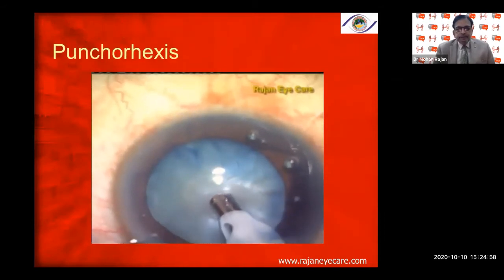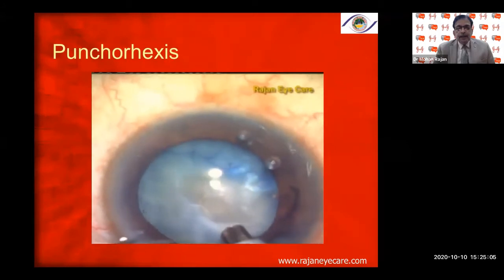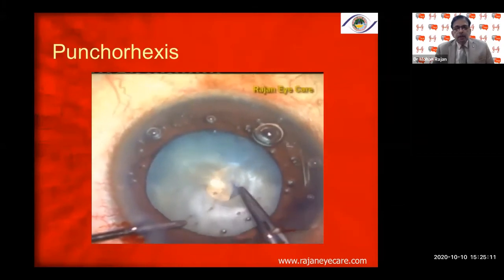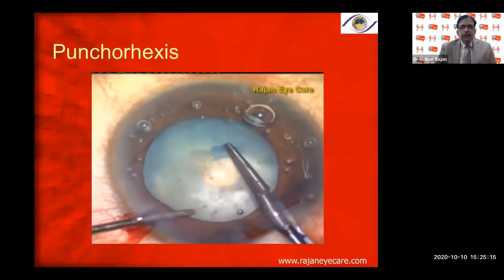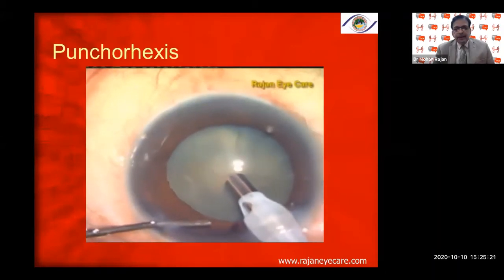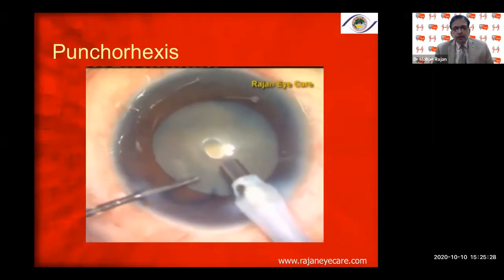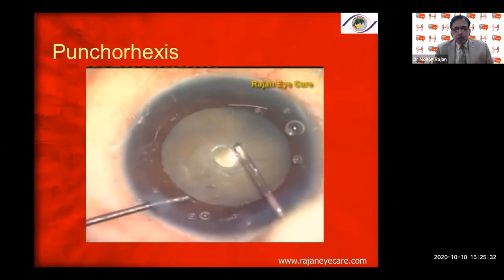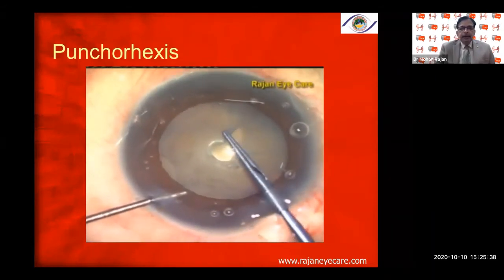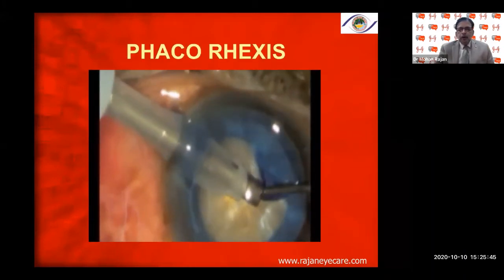You can see me punching — as I punch, I go all the way down on the foot switch. I'm not only punching the anterior capsule and decompressing the front and back compartments, but also providing faco emulsification which debulks the nucleus and pushes it back. There is debulking of the nucleus — the nucleus goes back, preventing it from coming forward, and decompressing both the front and posterior compartments simultaneously.